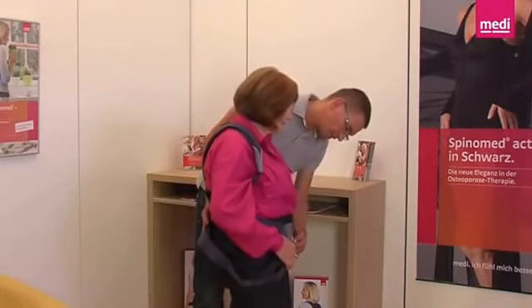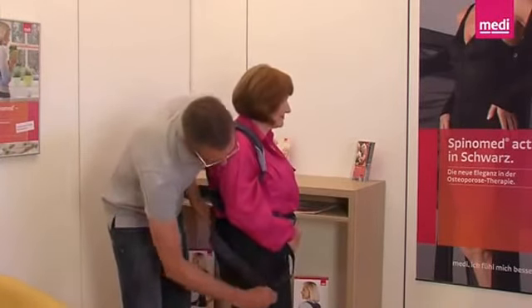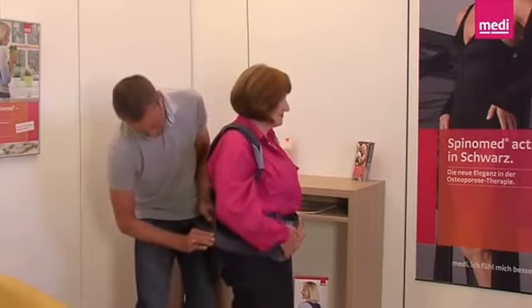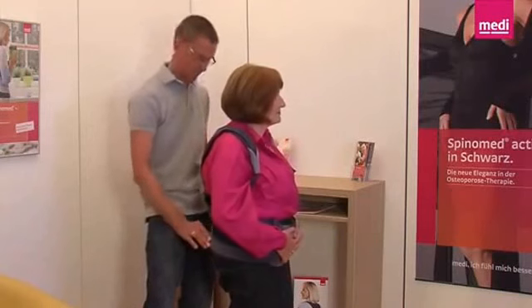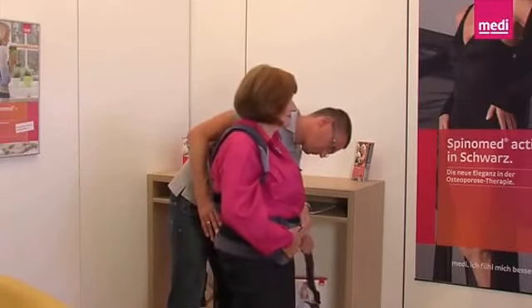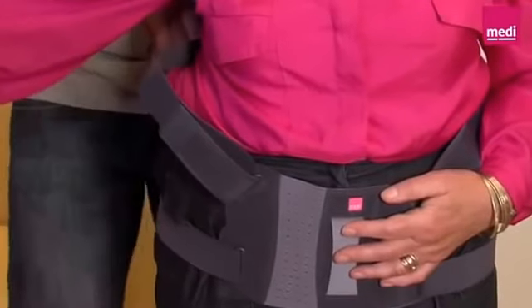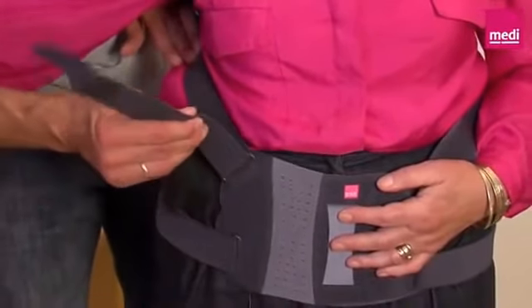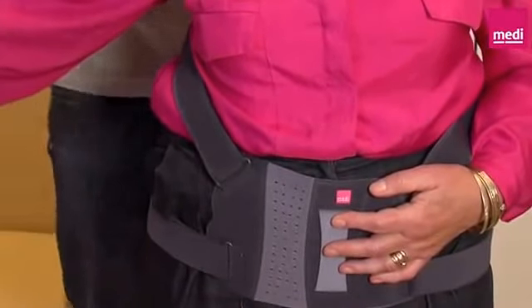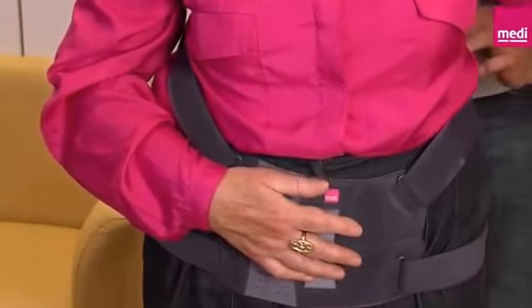Now check again whether the front pad is positioned correctly. Ask the patient to help by holding the pad themselves with their hand at the level of the pubic bone. Now pull the lower waist straps on both sides tight, one after the other, so that they fit to the body — this can initially be done provisionally, and the straps should not be trimmed at this time. Continue with the adjustment of the straps by setting both shoulder straps to the right length — pull the shoulder strap tight using the strap loop, always ensuring that the brace does not slip and that both the front pad and the back rod are positioned correctly.